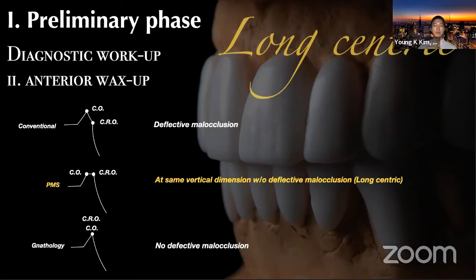That's the concept we are definitely applying to any full mouth rehabilitation, wax-ups, or prosthetic reconstruction. What I personally prefer to do is use shim stock with very thin occlusal paper. You check in the posterior, and every time the patient bites down, not clenching, we have a bilateral simultaneous contact on the posterior, followed by a slight pull-through of the shim stock, but the patient will have the AccuFilm contact on the anterior. That's how you can evaluate when you're final cementing your crowns, to maximize the stabilization of your occlusal reconstruction.